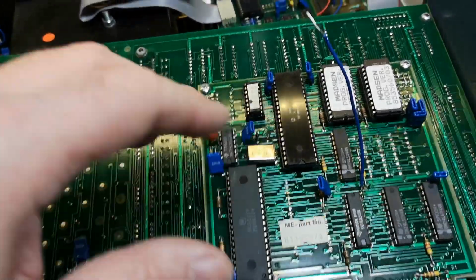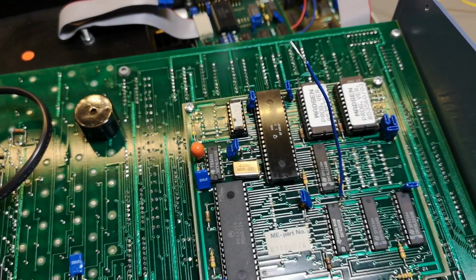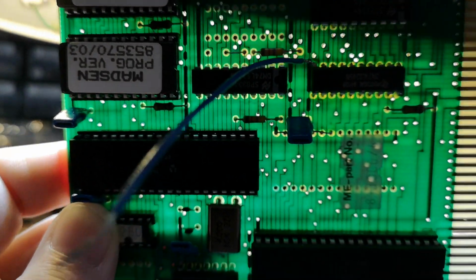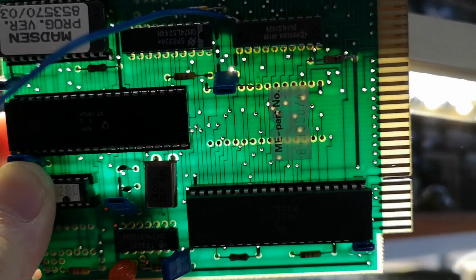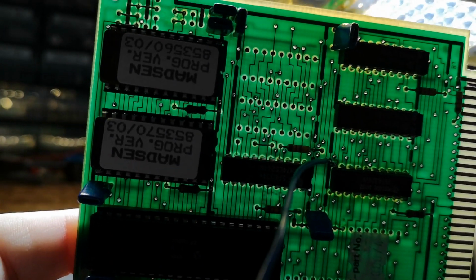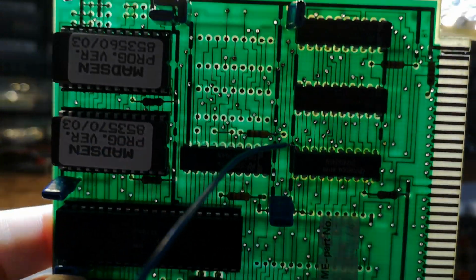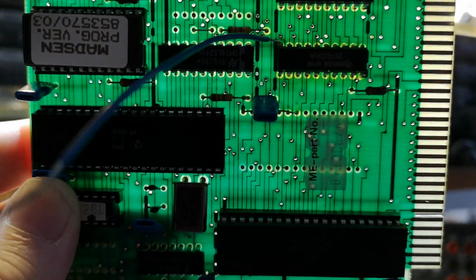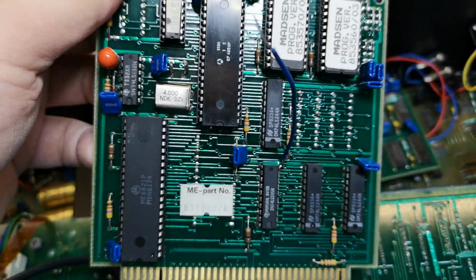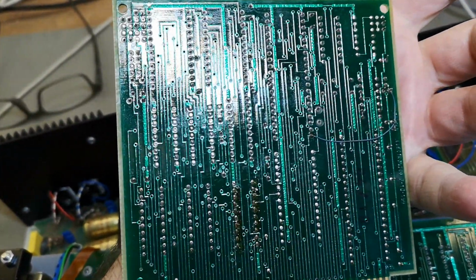I got all the correct voltages. I got plus minus 12 volts, and I got plus minus this and that. I got everything. Let's try and look a little bit on the CPU card. See, it is a 2-layer board with ultra thin tracks. So everything here is super inductive. And the layout technique here is, if I'm not mistaken, everything is horizontal on this layer and everything is vertical on the other layer.